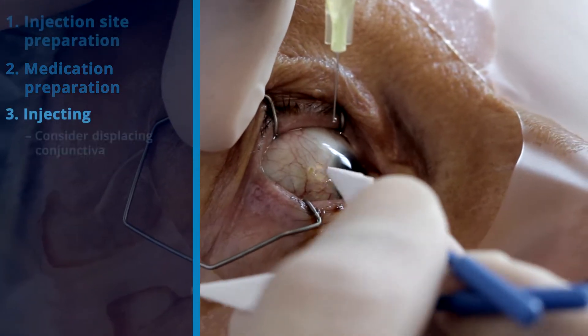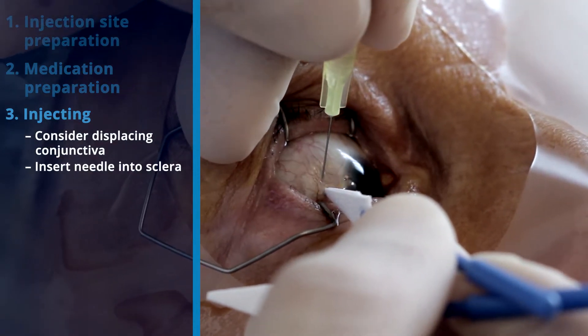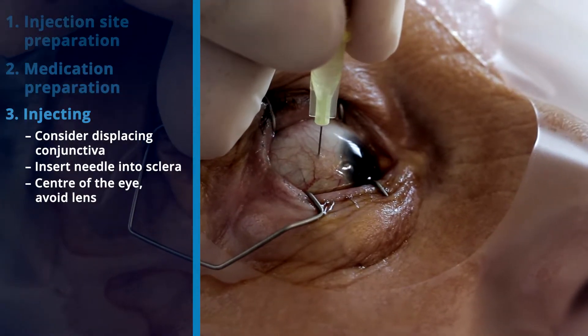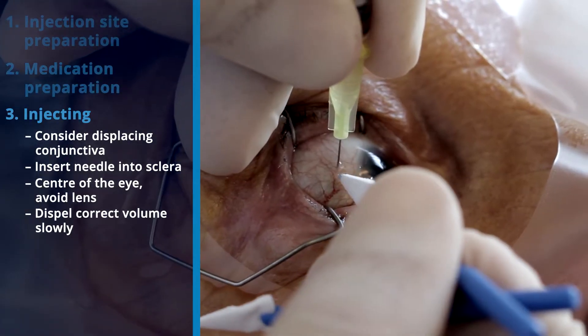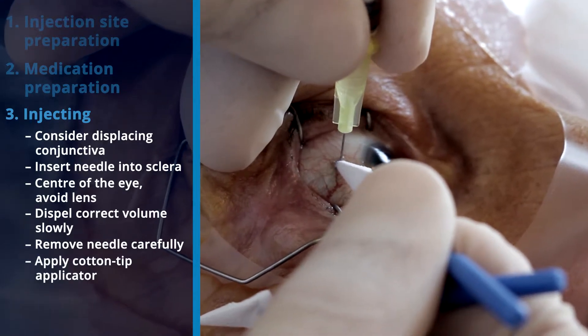Displacing the conjunctiva should be considered before injecting. The needle is inserted into the sclera towards the center of the eye, avoiding the lens. The correct volume of medication is carefully and slowly dispensed into the eye. The needle is carefully removed and a cotton-tip applicator is applied to prevent reflux.